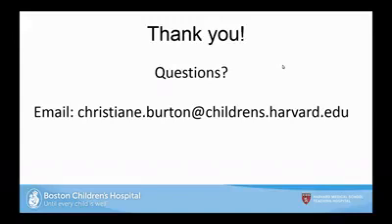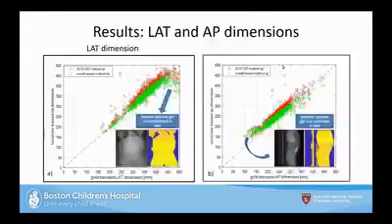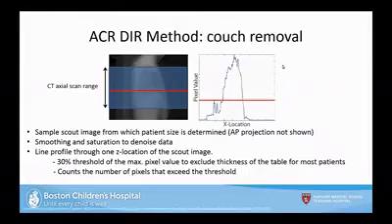So I think your method is a threshold method. Yeah, it has a failure. I think what Debbie's talking about is if you were to exclude the couch, your threshold method would actually be closer. Oh yeah, definitely. And if you already have it from the metadata, you don't do the threshold on the entire image, you do the threshold method on it more effectively. If we just go back to the picture, maybe I don't understand. You could just exclude, from the couch height, where the couch top should fall from this distance out. So anything from that point to the left, you would exclude from your image and then just threshold what's left.